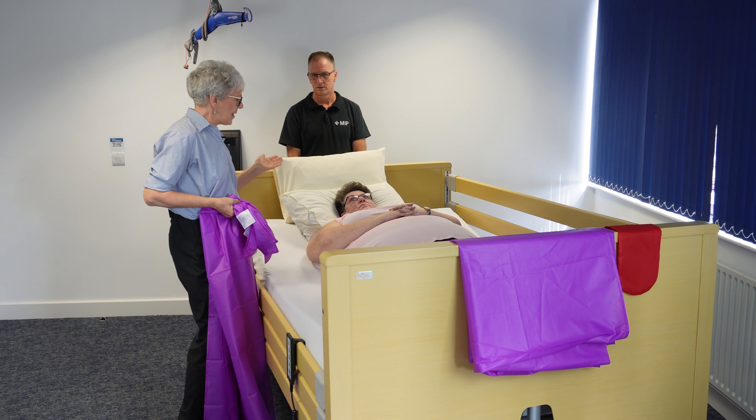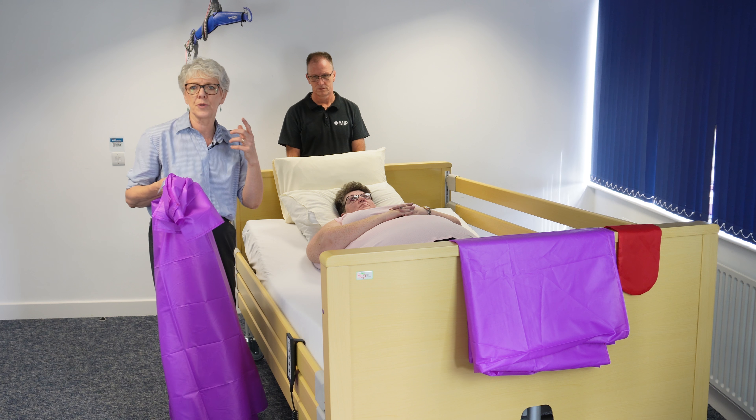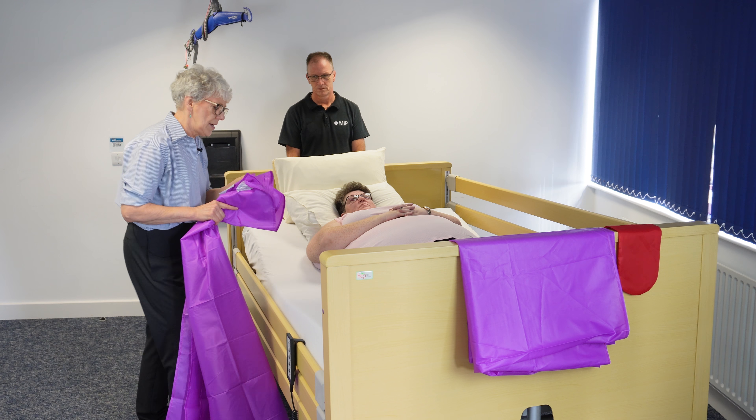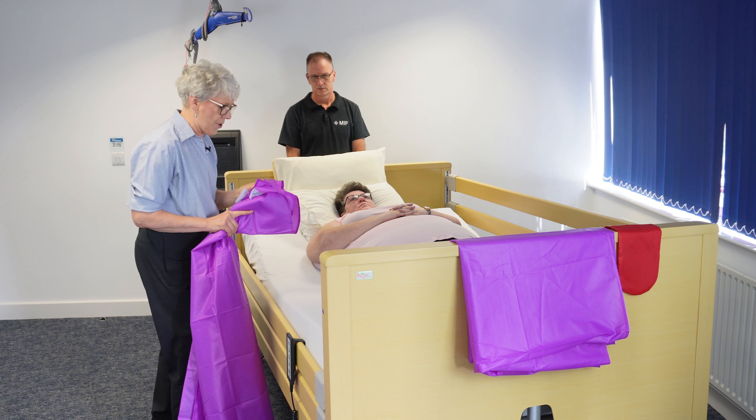We've just raised Lou's bed head up very slightly — it's slightly more comfortable for her, but it also helps to initiate the roll a little bit better. To stop us slipping down the bed, I've just very slightly brought the knee brake up.